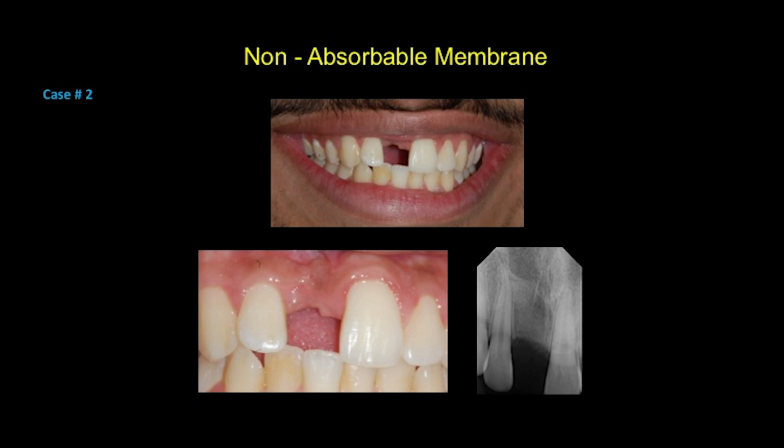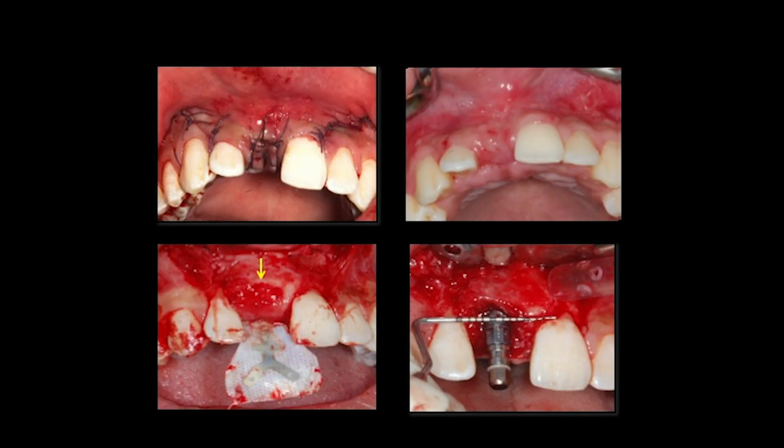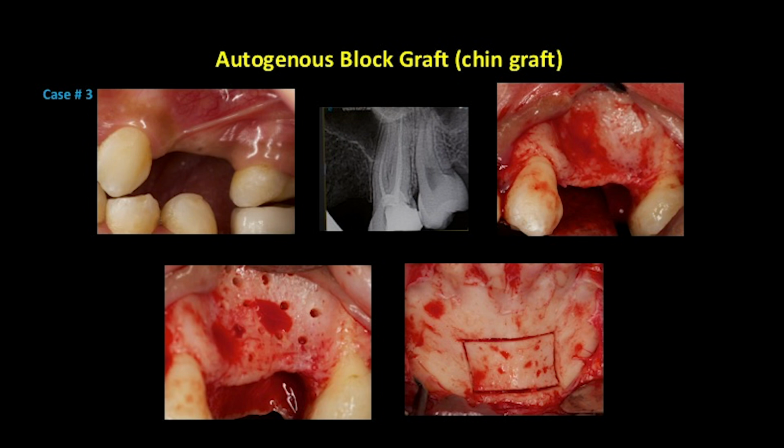This is the bone level Straumann SL active implant. This is the site after healing. This is a temporary crown for 3 months, and this is the final result after crown insertion with excellent soft tissue and integration at the site of augmentation. And this is the periapical radiograph showing the good level of the bone, the integration of the implant, and the crown contact. Case number 3.